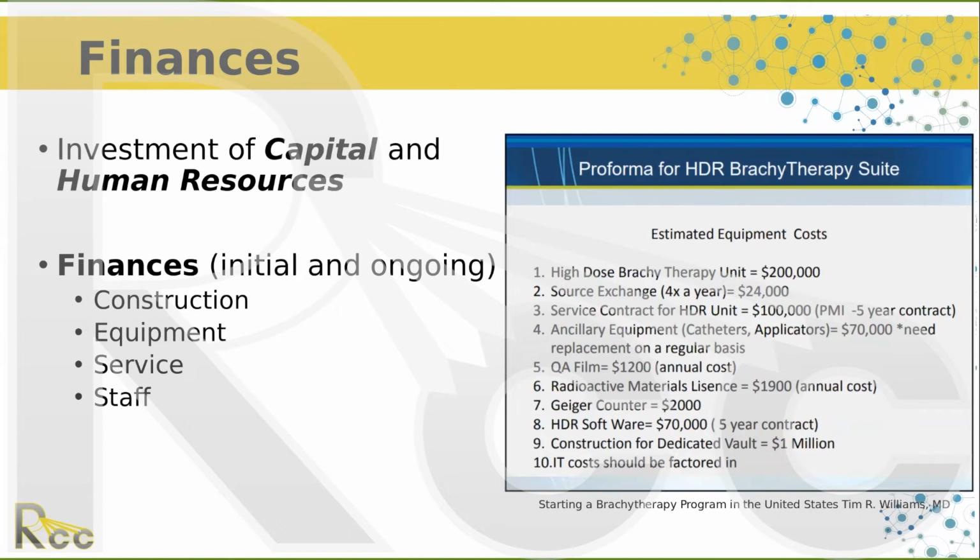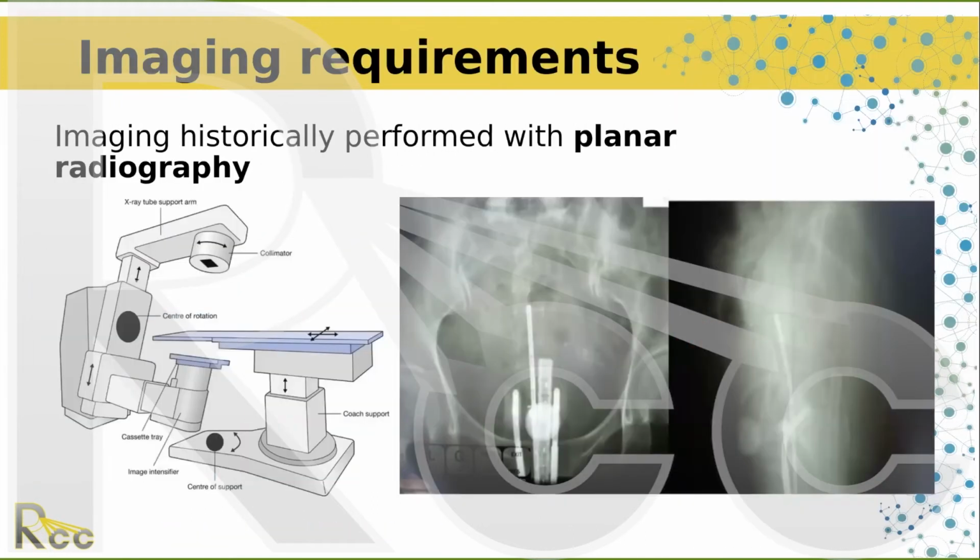We have another question, sorry if I mispronounced this, from Ayojani. When do we use the C-arm machine? Well, the C-arm can be used to take images, or to take planar radiographs. So this is essentially a C-arm. You can capture an image, AP and lateral, and you can use that to plan tandem and ovoids through the conventional method with your point A and point B.